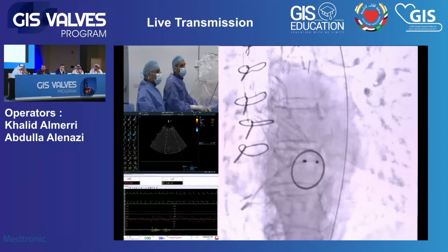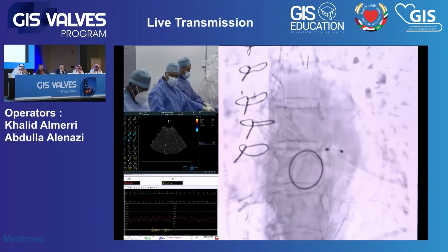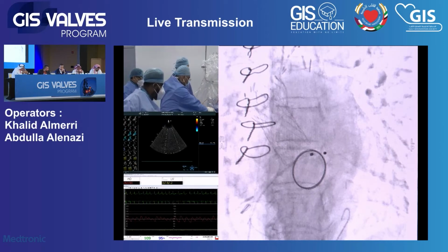So, what do you think, panelists? Maybe we take opinions. Would you go for post-dilatation? Would you stop here? This looks to be a reasonable, good result. I think this is a good result. I will stop here and I will not distort the anatomy. Muhammad? I think the gradient is beautiful.